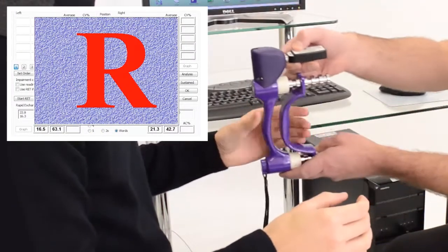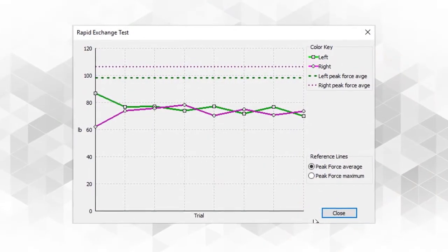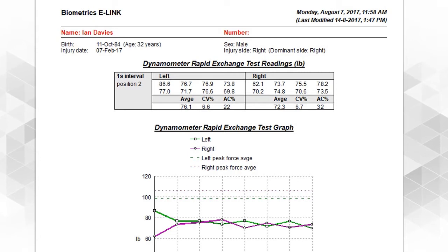The rapid exchange grip test for the detection of submaximal effort is easily performed and the results documented in both graph and table format.